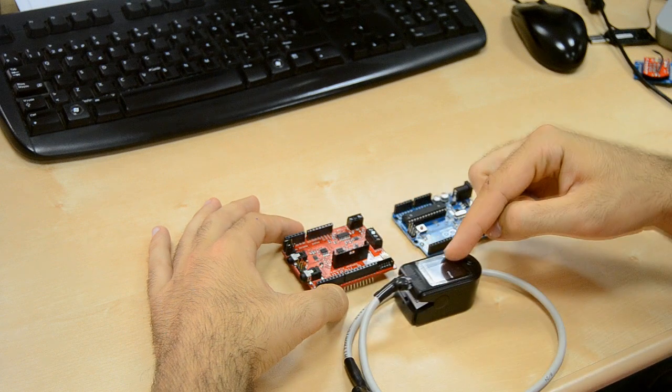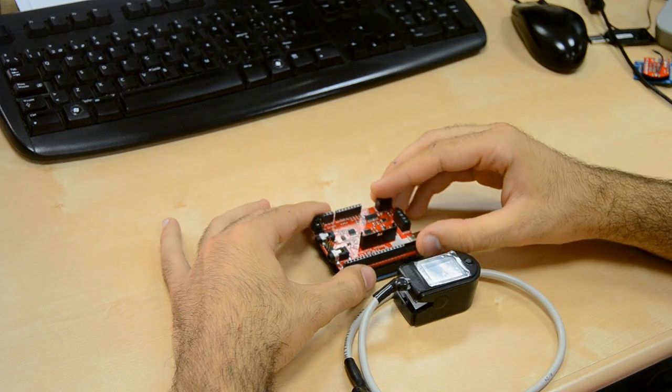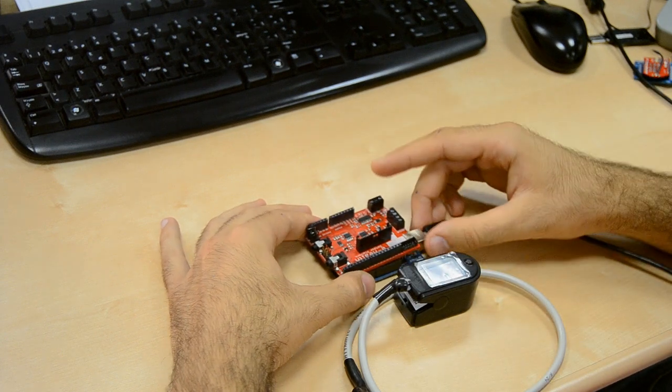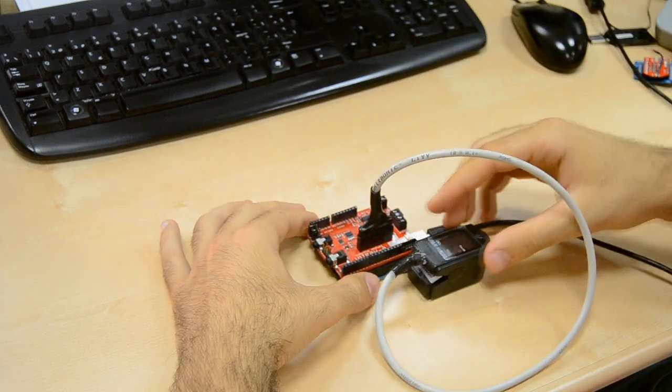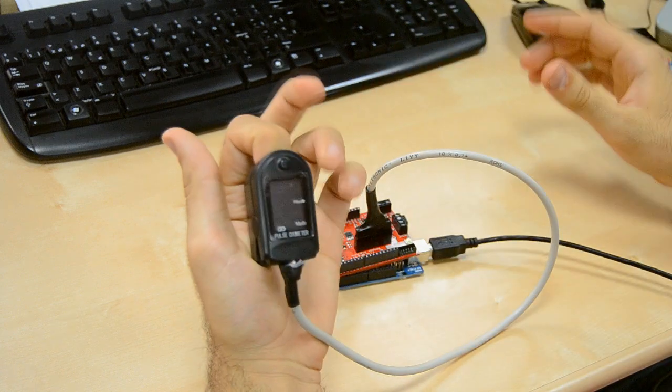As an example of use, I am going to connect the pulse and oxygen in blood sensors. First, connect the sensor to the Arduino and plug the sensor. Then just insert the finger and press the ON button.